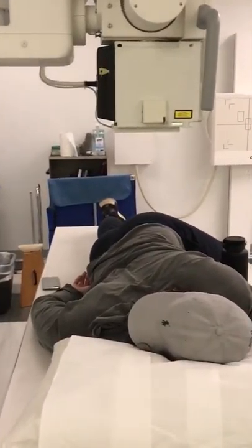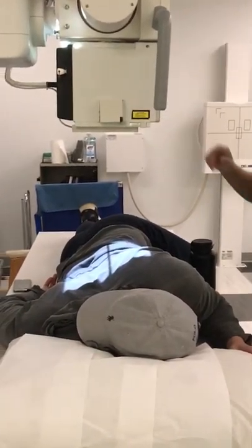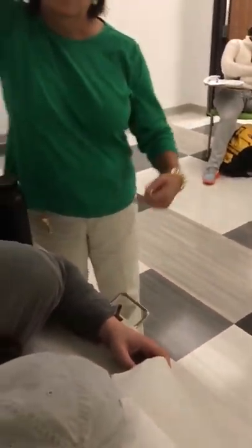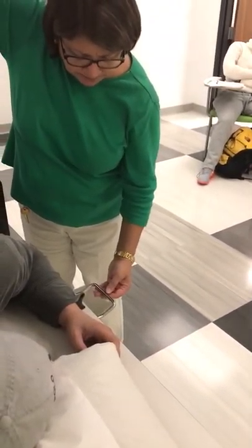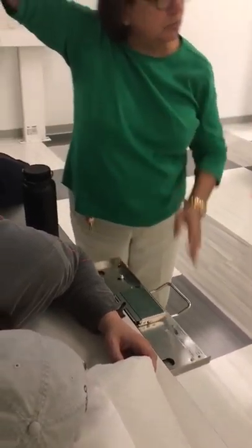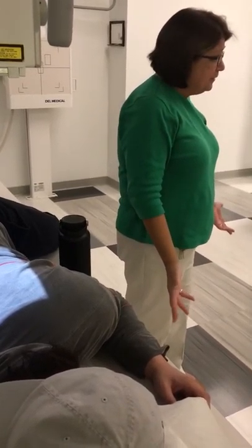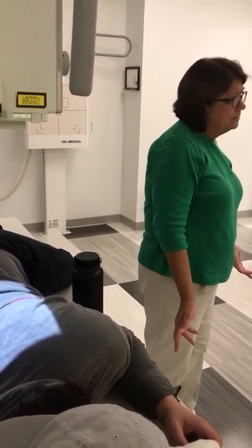Okay. There we go. You might be aware of that head. You want to lose it. So I moved my Bucky, did I not? Because I needed to reposition the Bucky so that the top of the IR was 2 inches above the shoulders. So I've got to make sure that my tube and Bucky are still aligned. You could do that too by not moving your Bucky. You could do it by moving the table instead of moving the Bucky.